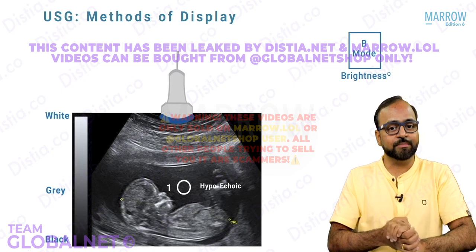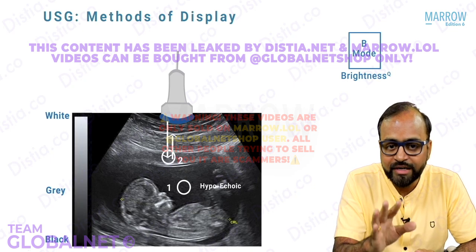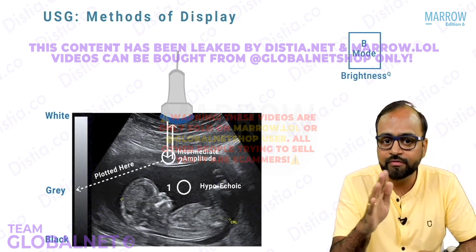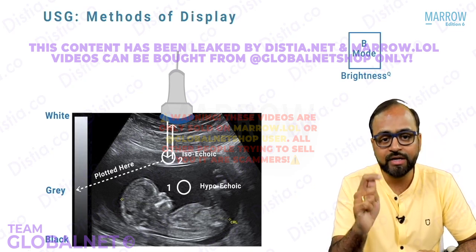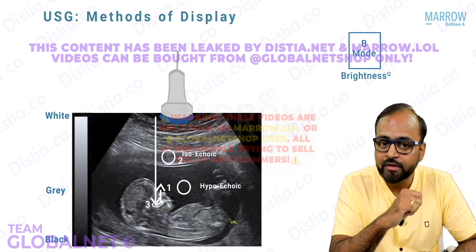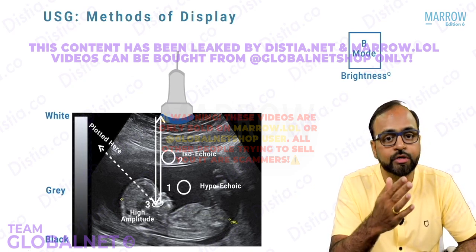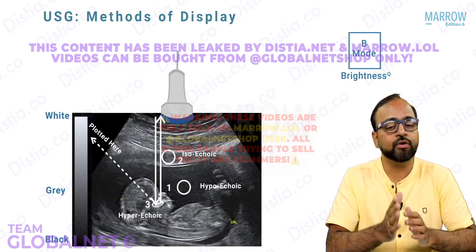Now see, let us take another example. The points in the area number 2, the machine found had an intermediate amplitude. So where will this intermediate amplitude be plotted? It will be plotted at the middle part of the grayscale, and therefore these points appear gray or isoechoic. Now look at another example. The points in this area number 3 had a very high amplitude of returning echoes. High amplitude of returning echoes will be plotted where? It will be plotted at the top of the grayscale, so white. Therefore these points appear white or hyperechoic.